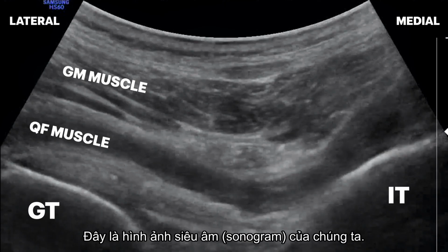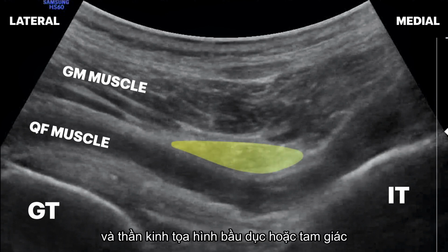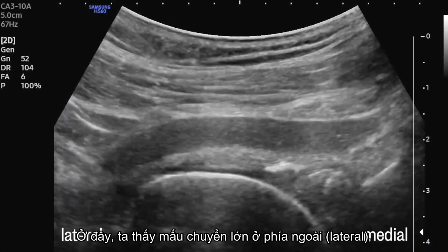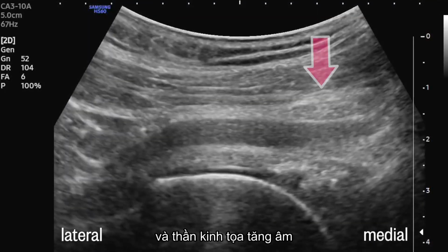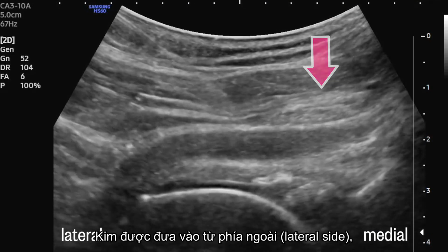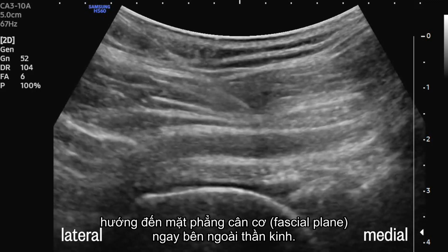Here's what our sonogram looks like. We see the hyperechoic bony prominences on either side, and the oval or triangular sciatic nerve sandwiched between the gluteus and the hammock-like quadratus. Okay, so here we see the greater trochanter on the lateral side and the hyperechoic sciatic nerve nicely sandwiched between the two muscles. The needle is advancing from the lateral side, aiming for the fascial plane just lateral to the nerve.